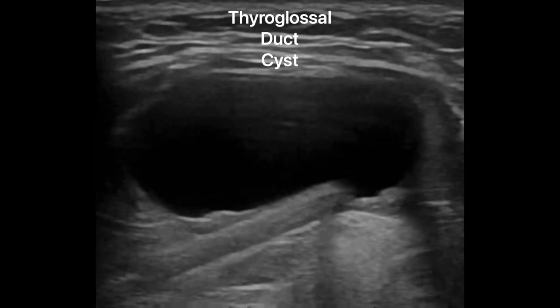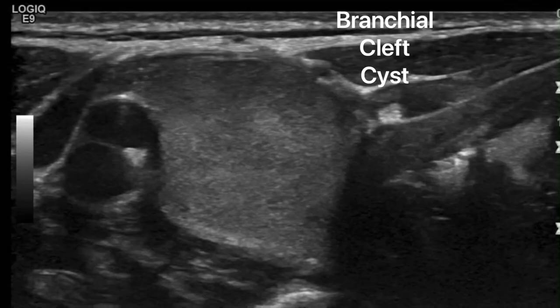Hey there, Sound of Peeps, how's it going? Henry here. Today let's go over thyroglossal duct cysts. The two common neck cysts you usually see are thyroglossal and branchial cleft. Today let's go over thyroglossal.